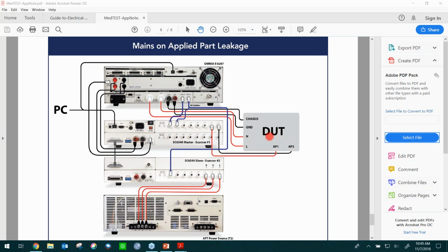So allow the unit to go to a full operational mode, allow it to leak the highest it can, and then measure the leakage current. Now, are you seeing additional leakage? Are you seeing more than what the standard recommends? This could also be internal. Most companies have internal documentation or internal compliance people available to answer these questions for you, or to create documentation to see what is acceptable risk, and what risk they can mitigate by not running these tests.